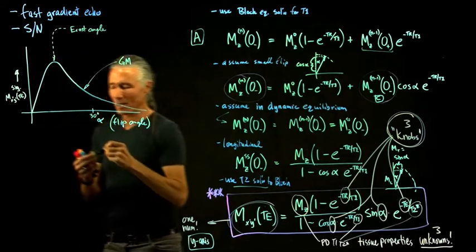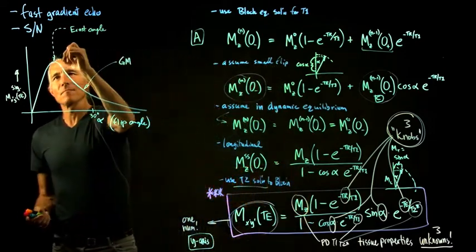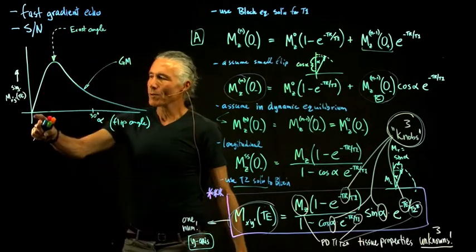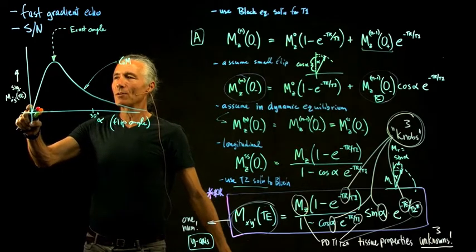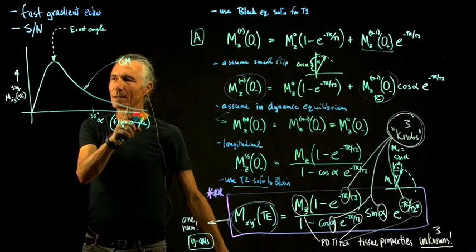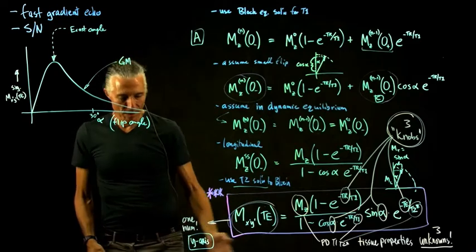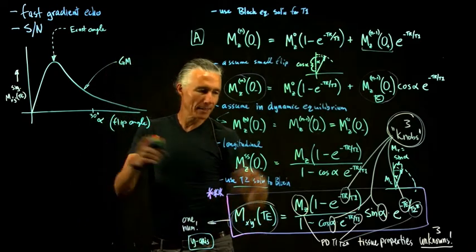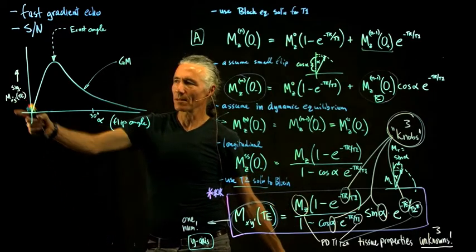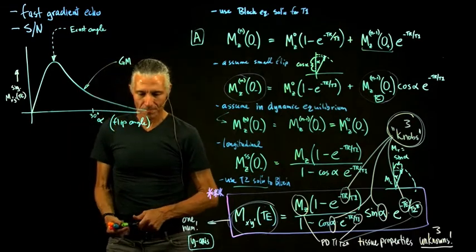And that's a useful thing because if we're doing a gradient echo, we always want the largest signal that we can get. And so we don't want to do a flip angle of 1. That would have almost no signal. It'd be a very noisy image. And if we do a flip angle of 60, we get almost 0 again. So you can write an equation for the Ernst angle that will tell you what is the flip that will give me, for this setting of all the other knobs, the most signal. But it turns out that's not what we want. So what is the problem?